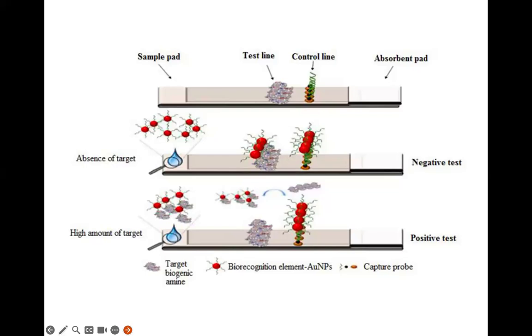So this is competitive assay. If you look at the structure of the lateral flow, the biggest difference is on the test line: we don't put capture antibody. Instead, they put the target analyte, which is the antigen. Okay, they put the target analyte, and then what happens is, please look at the structure.